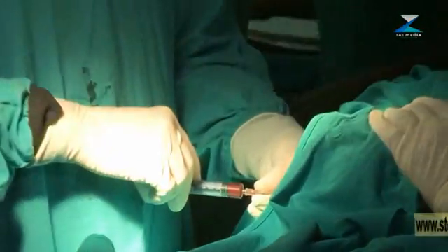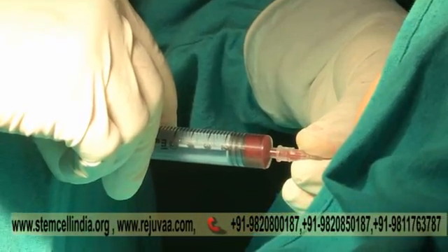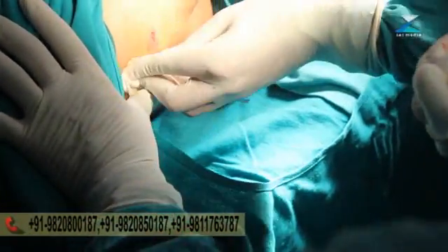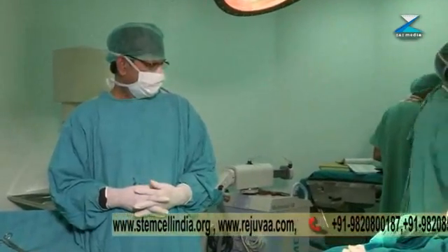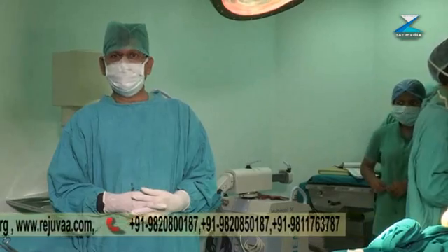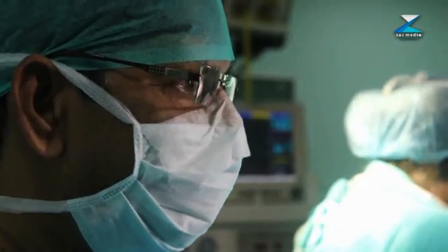You can see that I am injecting mononuclear cells intrathecally into the CSF. So this way we have done autologous mononuclear cell transplantation in this case of cerebral palsy, which has not been improving for the last two years — the child cannot take side turns, cannot speak, cannot understand. There is global developmental delay in this spastic quadriplegia, and for such intractable problems we are offering a ray of hope. We have achieved substantial results in such cases in our series done over the last couple of years. Thank you.